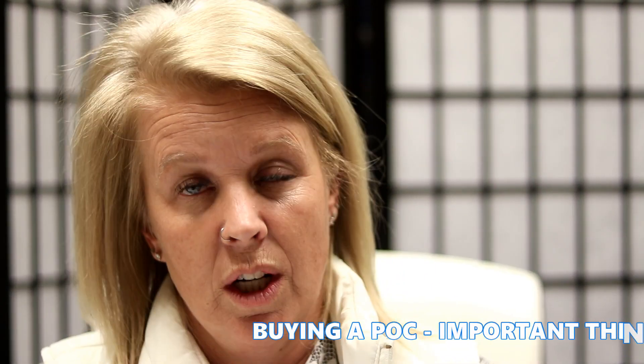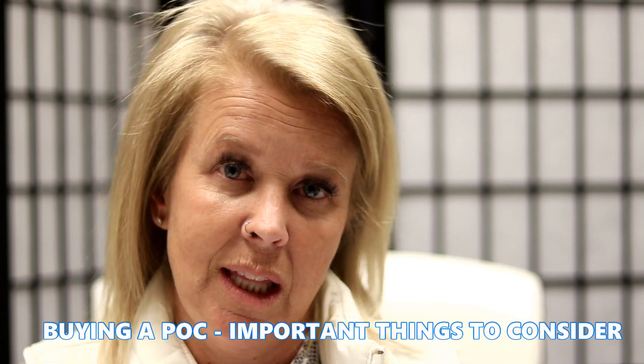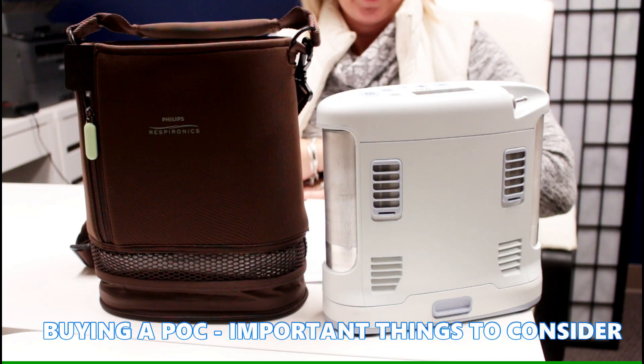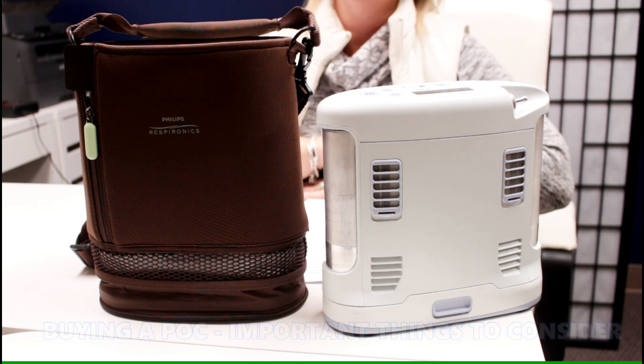When you are in the market to buy a portable oxygen concentrator, there are a few key things that you really need to think about. You should ask yourself: what are the dimensions of the portable oxygen concentrator? Where are you going to be taking it? Where will it be sitting? Just make sure that it fits in the area that you would like.